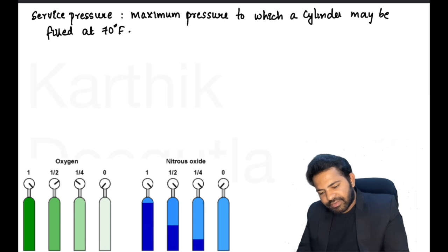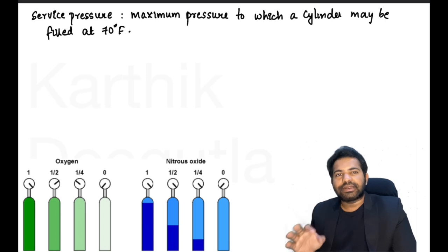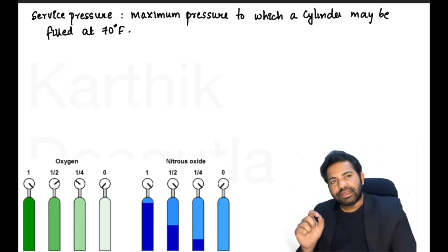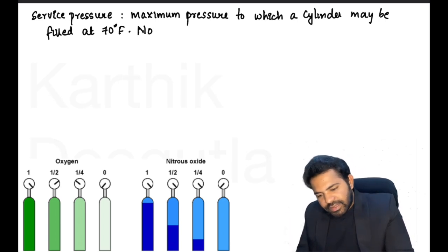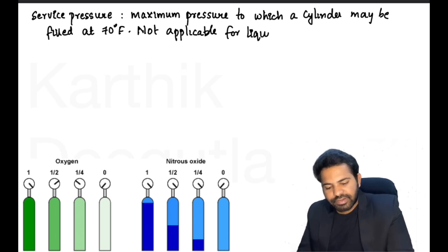This service pressure is applicable only for cylinders which have gas and not liquids. It is not applicable for liquefiable gases.